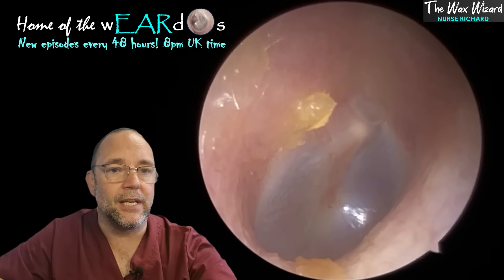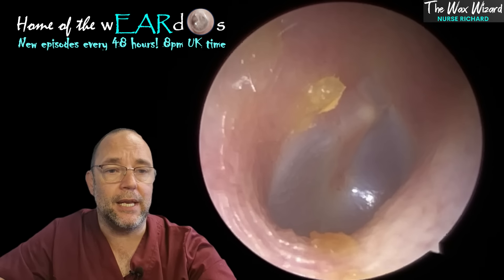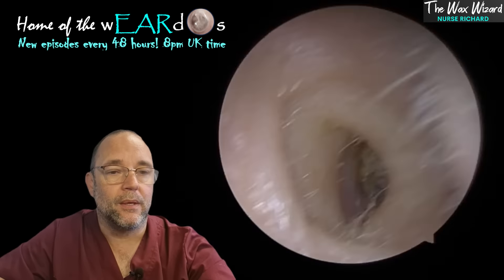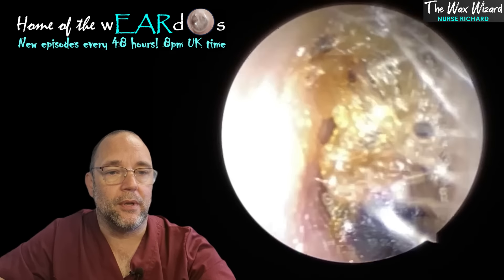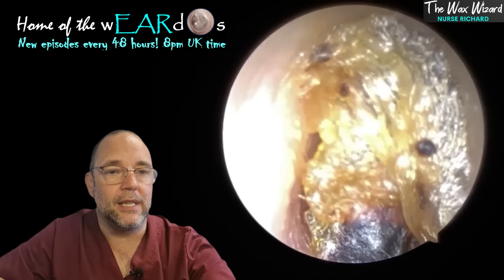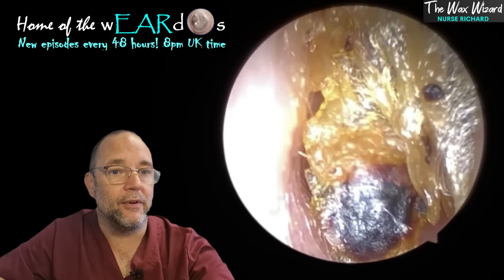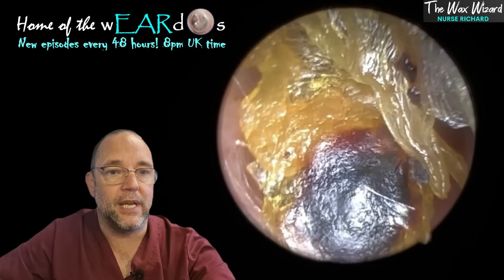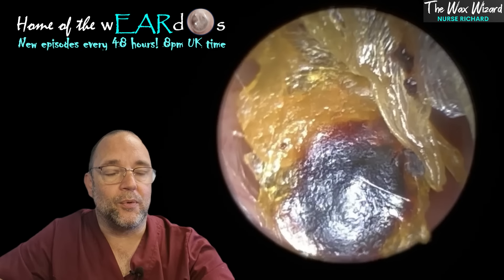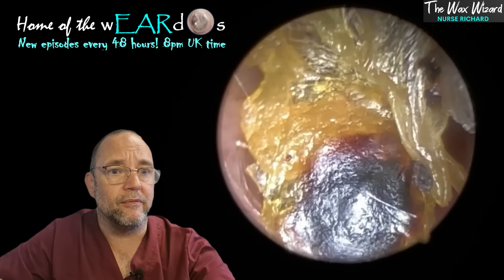She didn't actually notice too much of a hearing loss, believe it or not, with this in her ear — which is surprising, really, because it's sitting right on there. But as you can see, that lifted up there nicely. There are a couple of little specs left; I'm not entertaining going down to the eardrum for those — there's no clinical need or benefit to getting them.